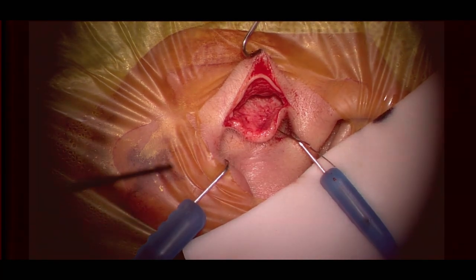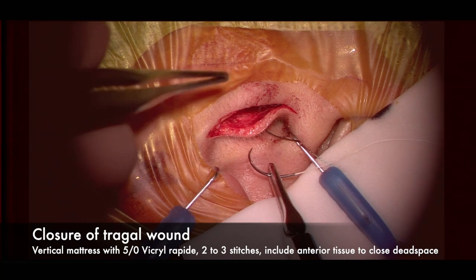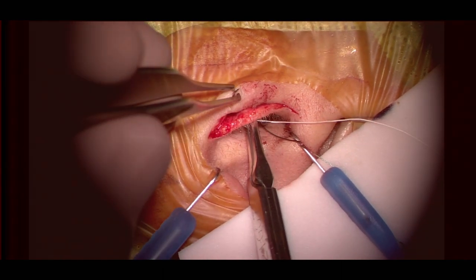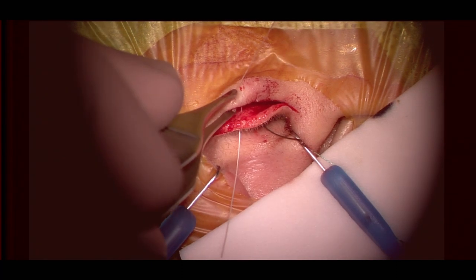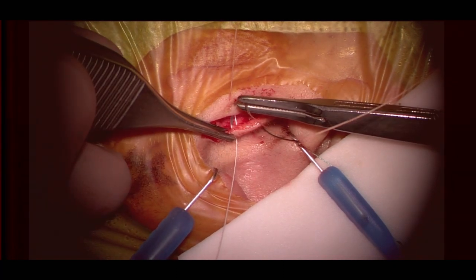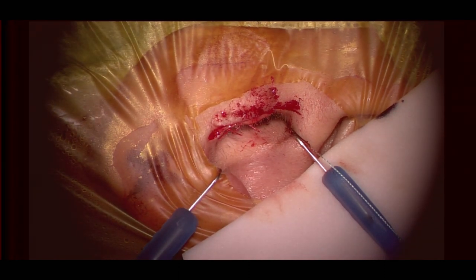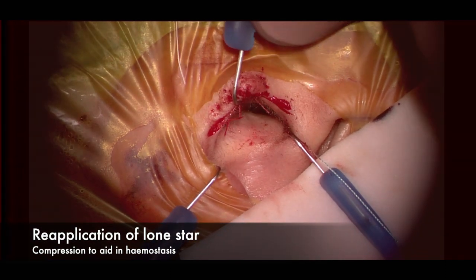Turning attention to the tragal wound — judicious diathermy should be used with bipolar at around setting six. Usually minimal diathermy is required. Using 5-0 Vicryl Rapide with a vertical mattress suture, entering the incision line at around 45 degrees to close the dead space as best as possible. Usually two or three sutures are required. A nice tip is to replace the lone star back onto the wound to allow a little more tamponading of the area.